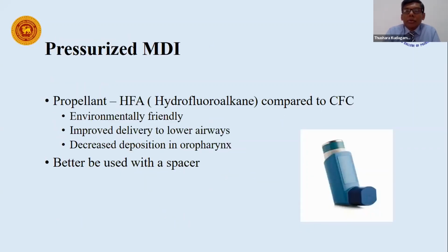So earlier there was so much talk about the CFC, which is no longer in use as a propellant. Now we have the HFA, which is considered more environment friendly, and also it has better delivery of the medication to lower airways than CFC. And MDI, especially in children, it's better to be used with a spacer.